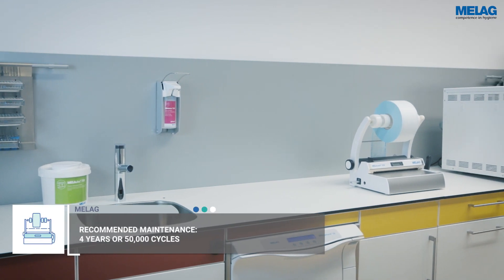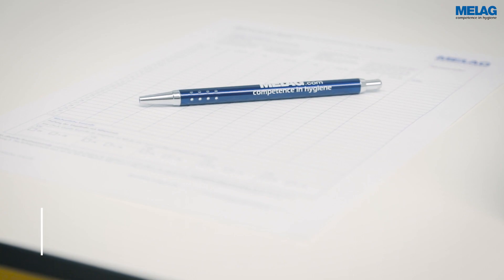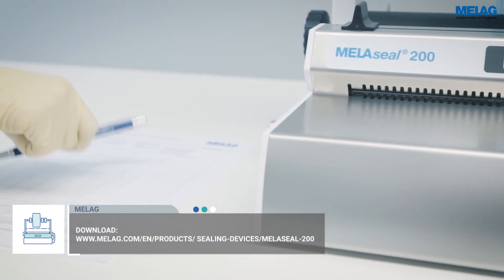In addition to the maintenance of the MieleSeal 200 by a trained service technician, you can control the function of the sealing device with routine checks. Document the results of the routine checks with a checklist. You may download a template from the MieleG website.